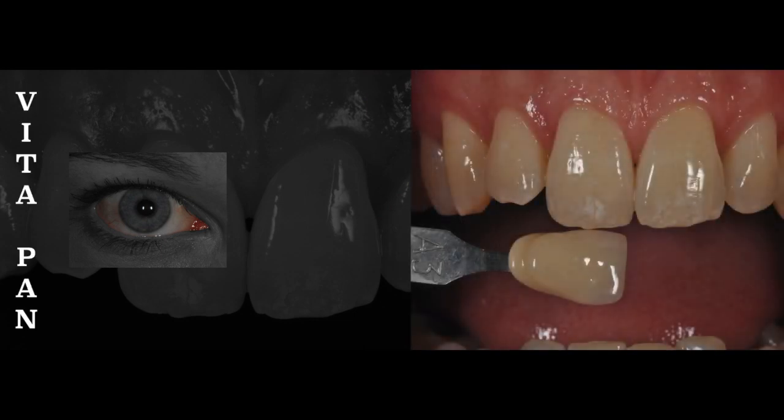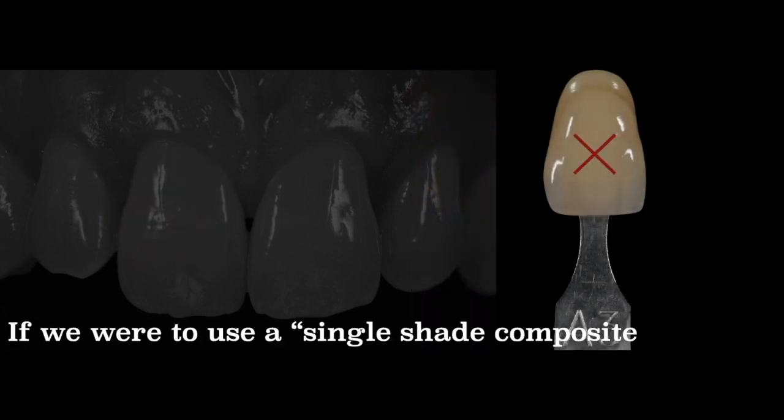So the way that many authors, and myself included, recommend positioning the shade tab for composite shade selection is in a horizontal position so that our eyes can focus on the middle third of the tab, where color is uniform and has no effects like saturation or translucency affecting it. So today the question is, if we were to use a single shade composite, what happens with shade selection? Well, the answer is easy. It is not needed because you only have one shade to go for.